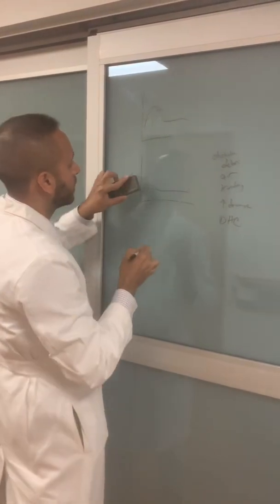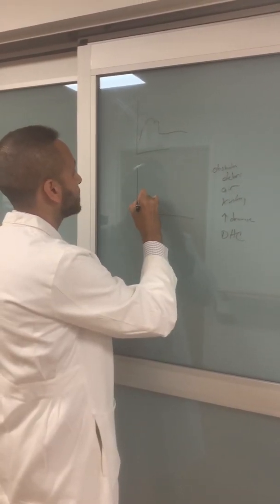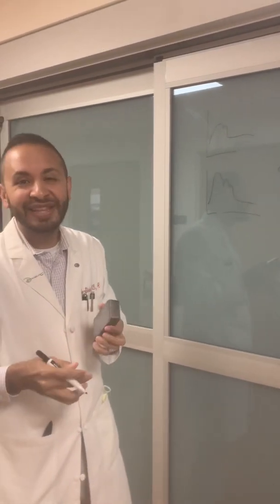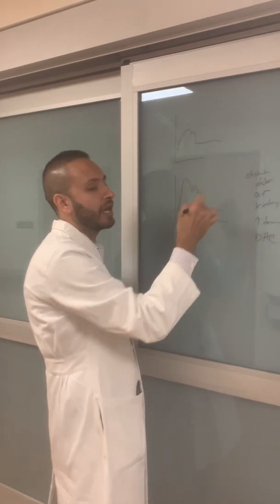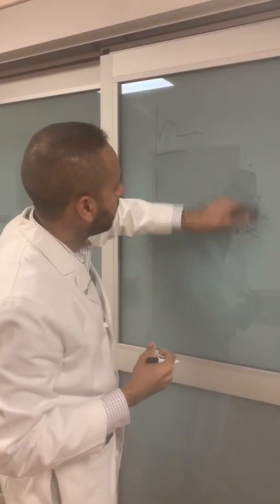What if you start to see a very high waveform compared to your normal waveform? That can happen when there's actually an increase in CSF, so there's too much CSF, so basically an increase of pressure. This can be a warning sign that your patient's ICP is starting to increase, all right?